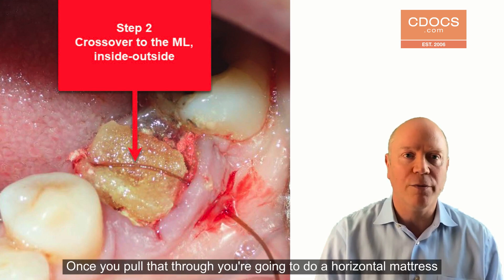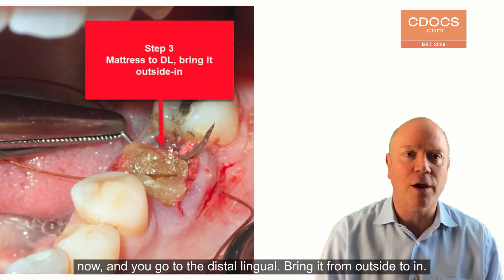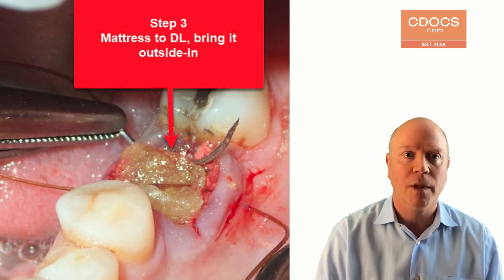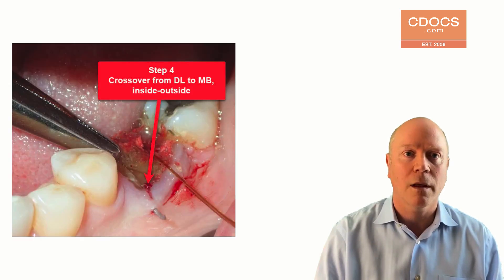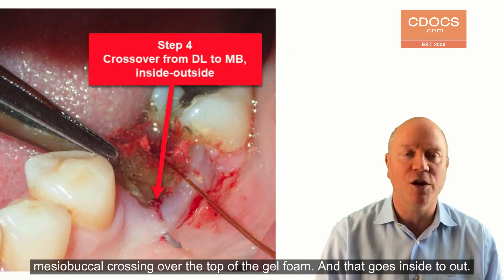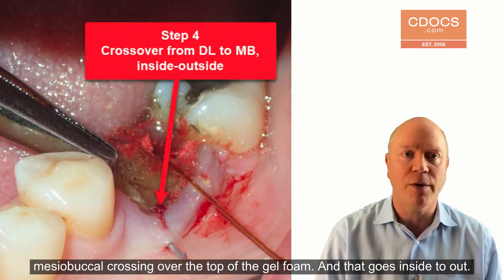Once you pull that through, you're going to do a horizontal mattress now. And you go to the distal lingual — bring it from outside to in. And then you're going to cross over again from that distal lingual to the mesial buccal, crossing over the top of the gel foam. And that goes inside to out.